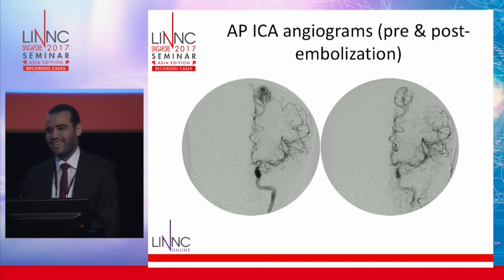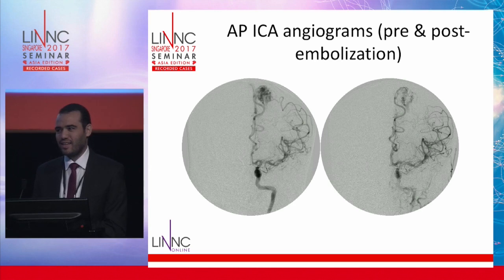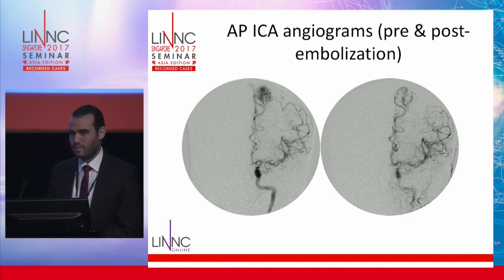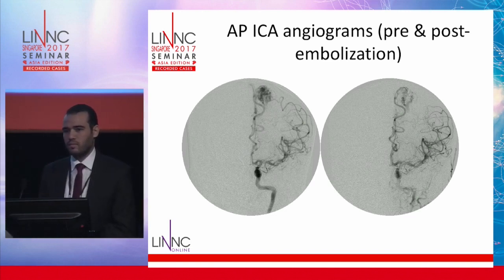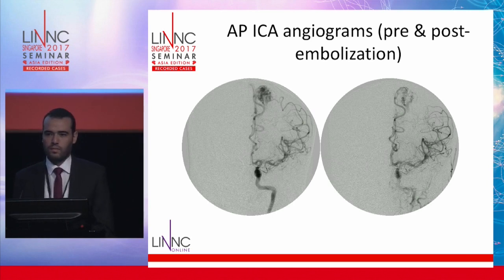No, but staged procedure is a way to deal with big AVM. In this case, it's a little bit doubtful because it's not that big. But you have to stage the treatment if the AVM is too big. Here it is small, and he perforated the AVM, and he terminated the procedure urgently. He cannot continue the procedure. No. Usually, it's very frequent that you have a rupture during the embolization, whatever is the liquid embolic you are using.